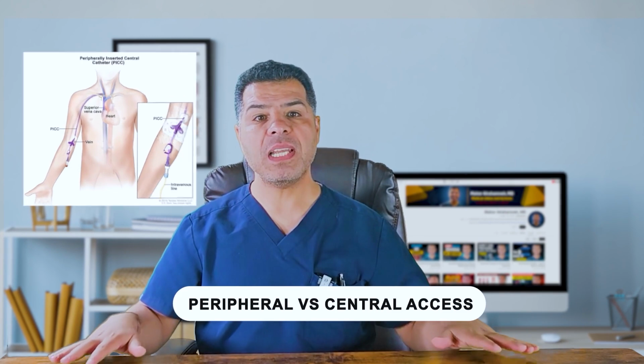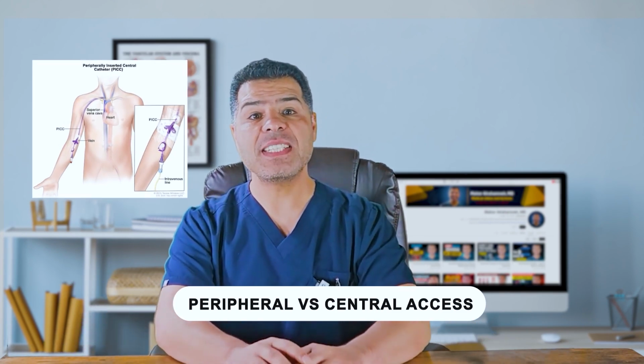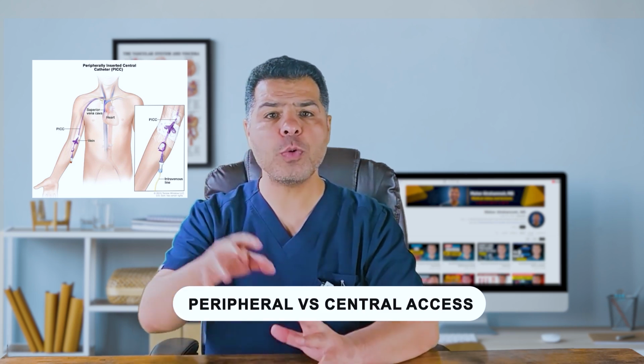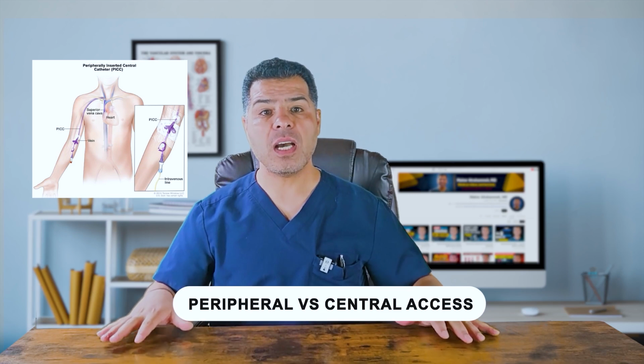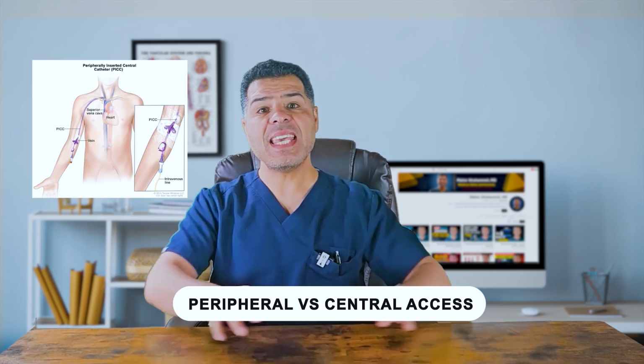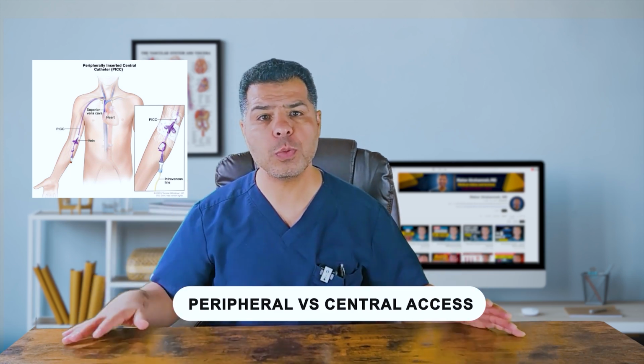Next, we have PICC lines, peripherally inserted central catheters. These are placed in the arm and their tips end in the superior vena cava or atriocaval junction. PICC lines are used for long-term therapy from several weeks to a few months, and they can handle TPN, antibiotics, chemotherapy, and most continuous infusions.